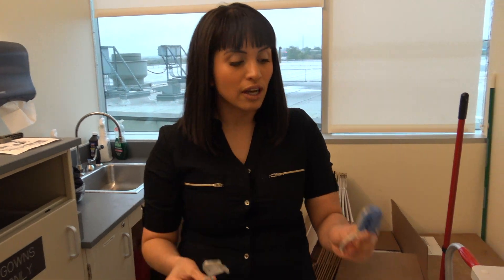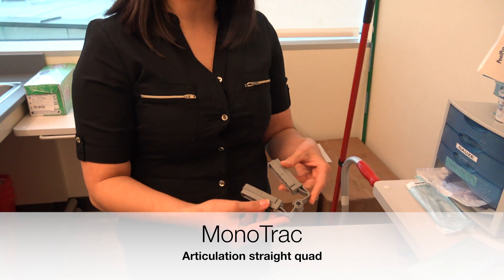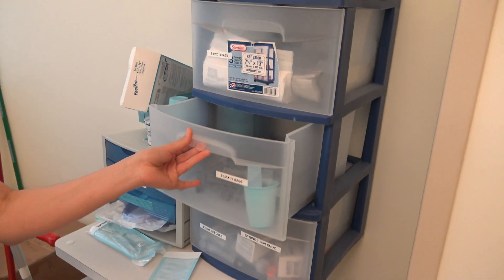You start with a metal impression tray and then you get your impression. To pour it up you're going to need the monotrack mounting system, which comes with four components.